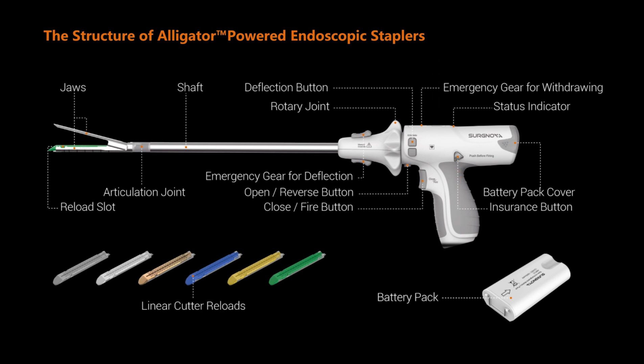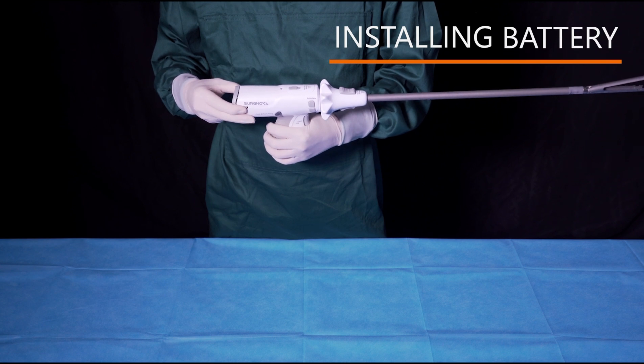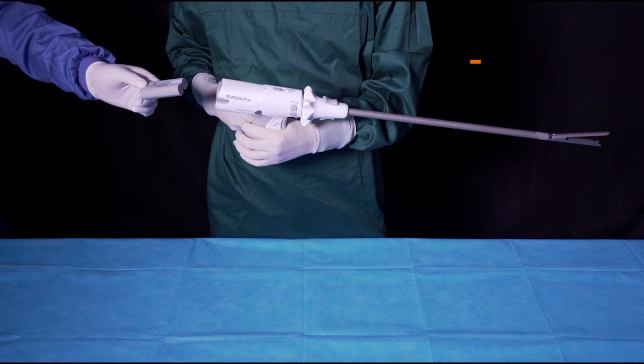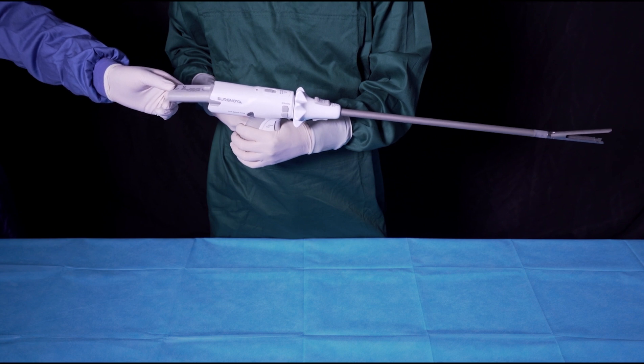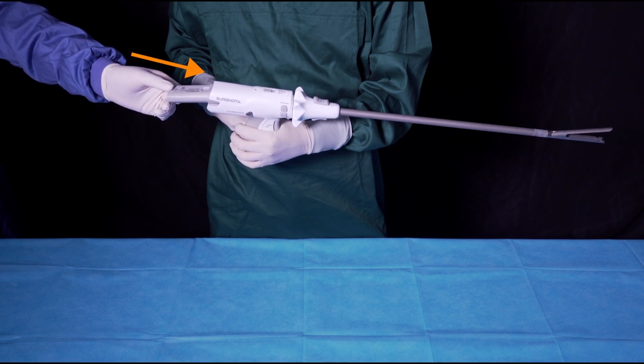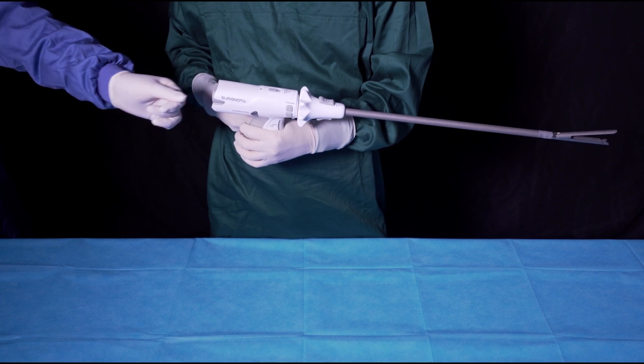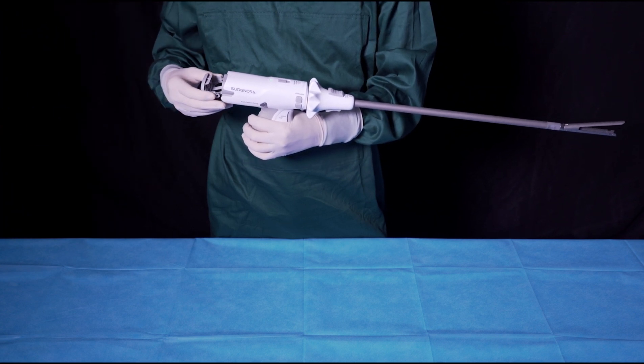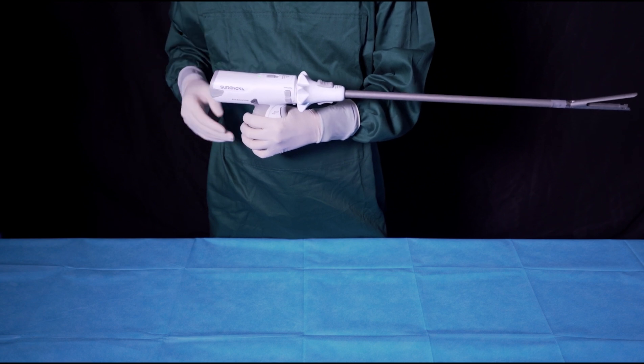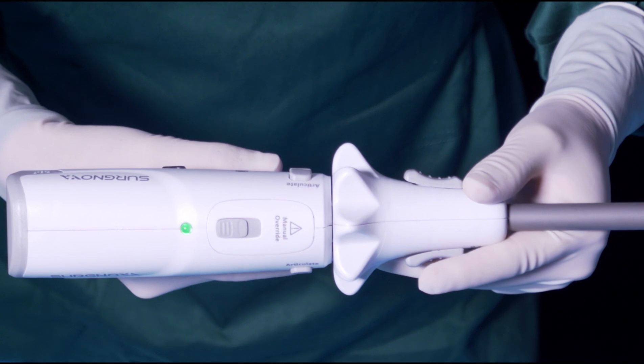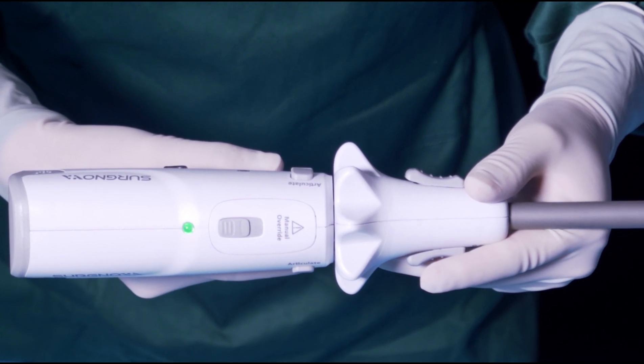Now, let us see how to operate it. Scrubbed nurse opens the battery pack cover. Circulating nurse inserts the battery pack along the direction of the arrow on the battery pack. Be careful not to touch the stapler. Scrubbed nurse puts back the battery pack cover without touching the battery pack. When the battery pack cover is put back in place, the status indicator on the top of the stapler is green.